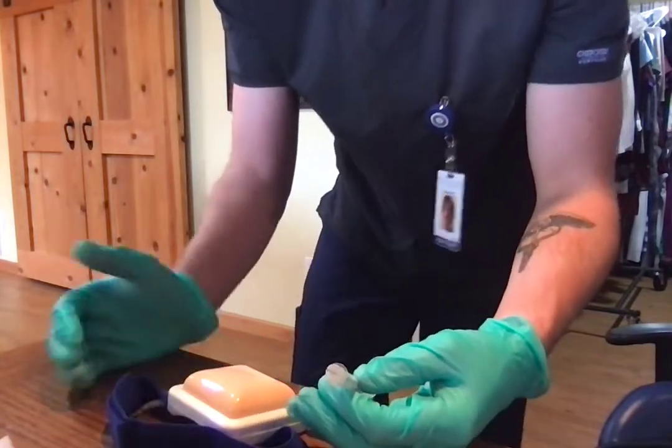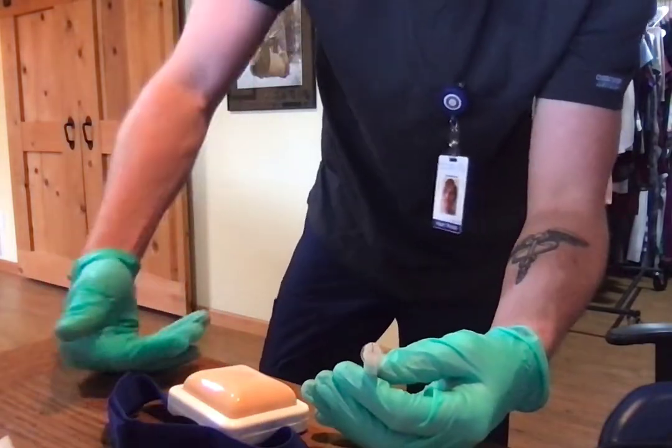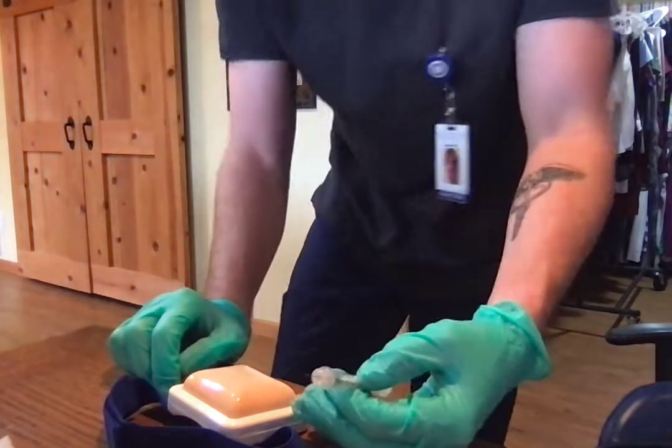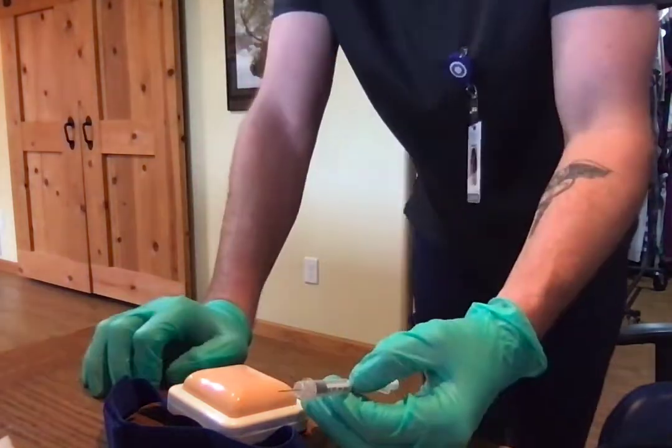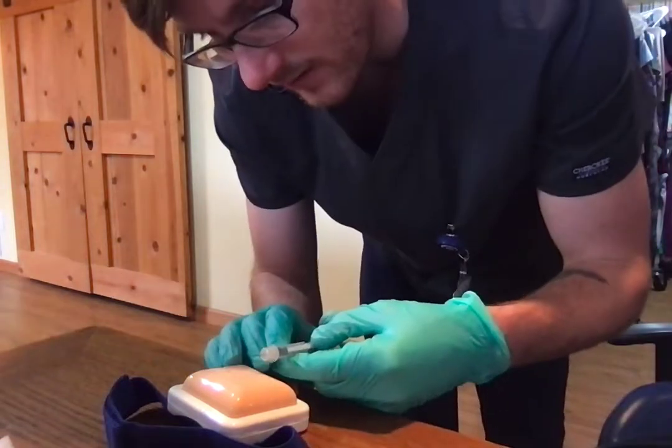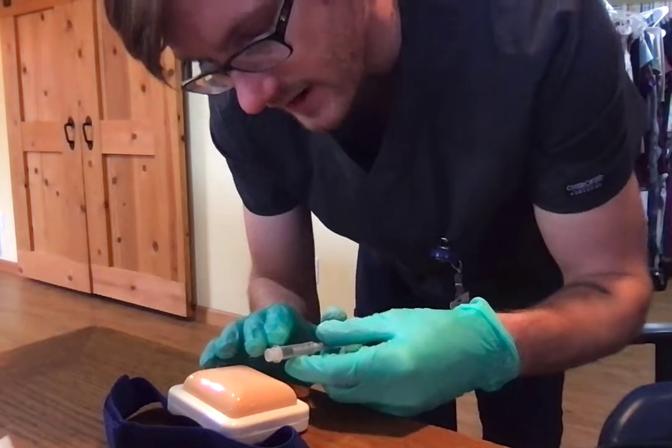And I want to make sure that they know to not rub this in. I'm not going to put a bandage over it, to be aware of any adverse effects after the fact, and to come back in 48 to 72 hours to get the TB test read to be either positive or negative.